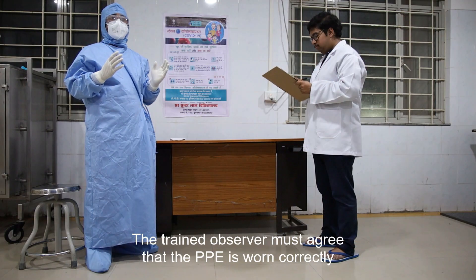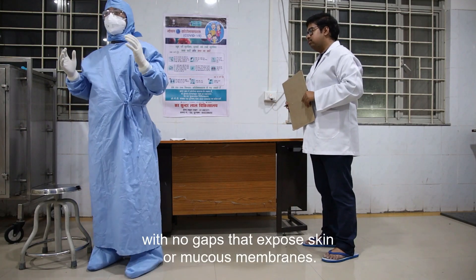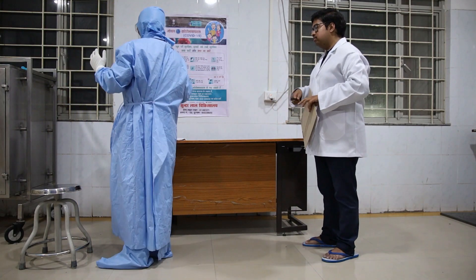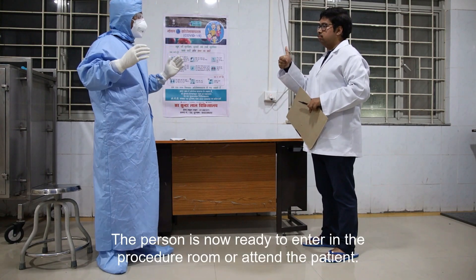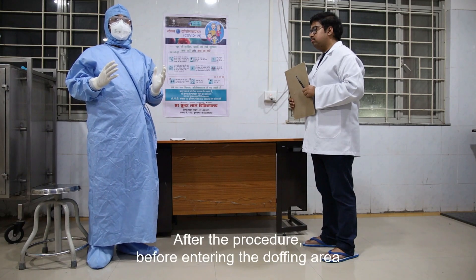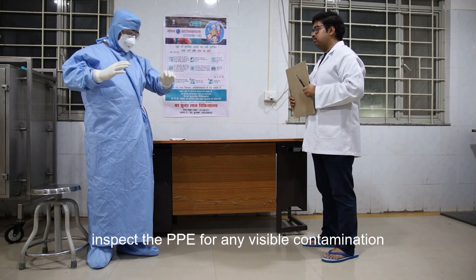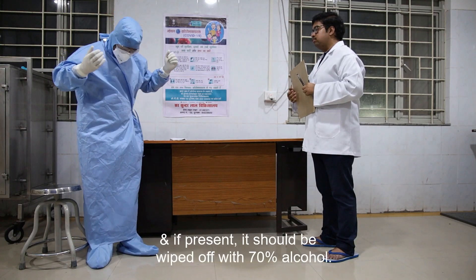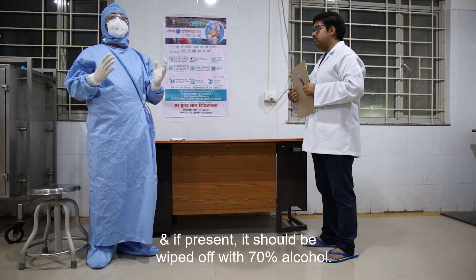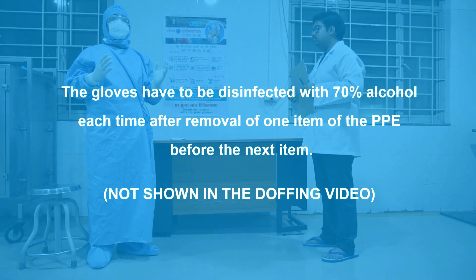The trained observer must confirm that the PPE is worn correctly with no gaps that expose skin or mucous membrane. The person is now ready to enter the procedure room or attend the patient. After the procedure, before entering the doffing area, inspect the PPE for any visible contamination; if present, it should be wiped off with 70% alcohol. The gloves must be disinfected with 70% alcohol each time after removal of one item of PPE before proceeding to the next item.